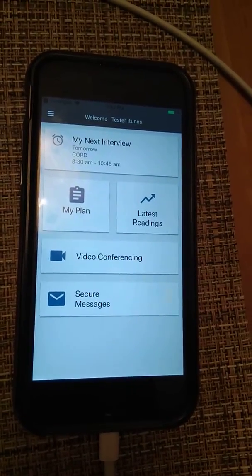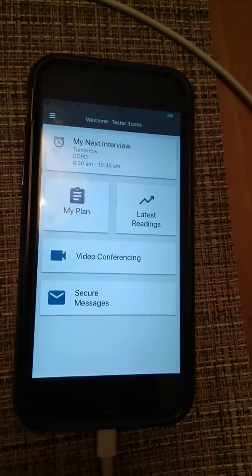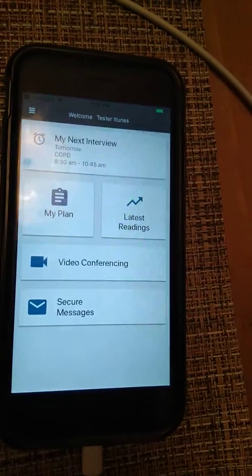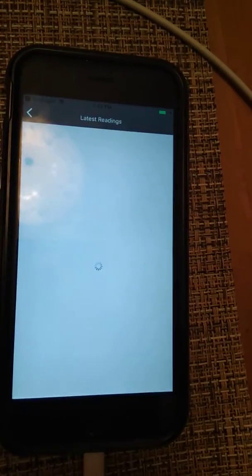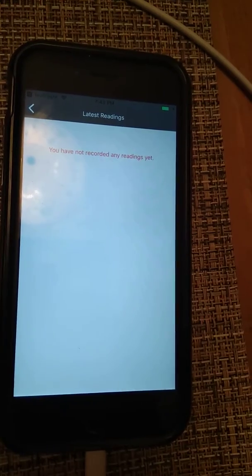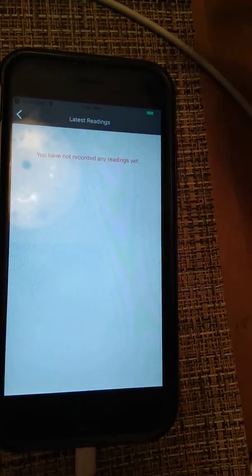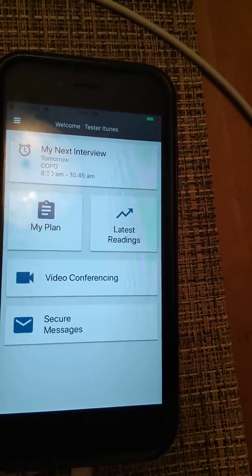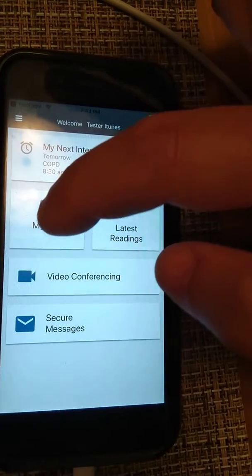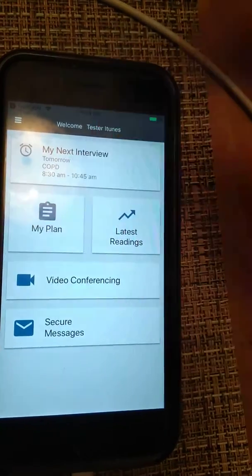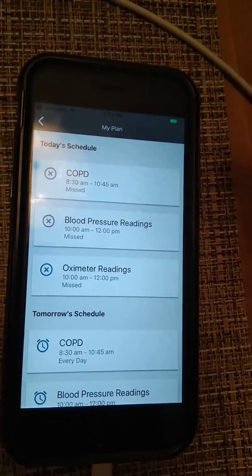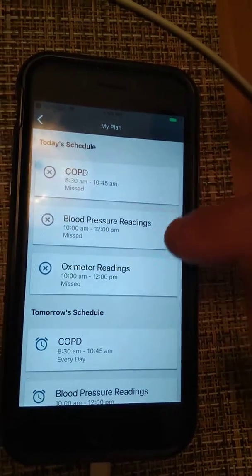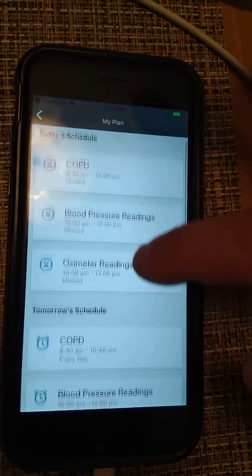As we log in, we can see latest readings — we don't have any readings yet. We can do My Plan, which will take us to our medical interviews.